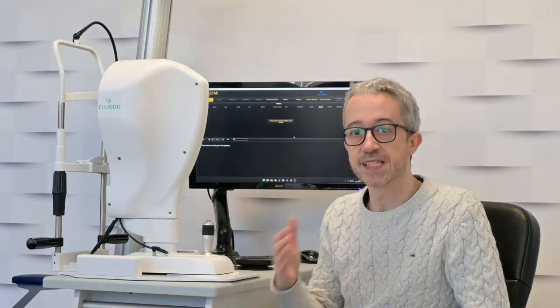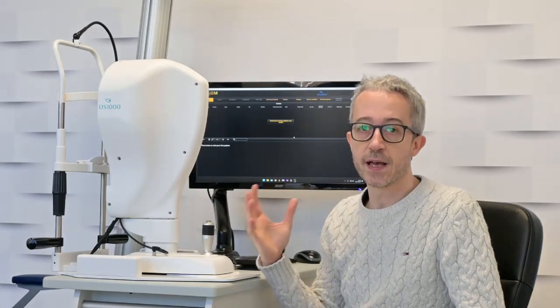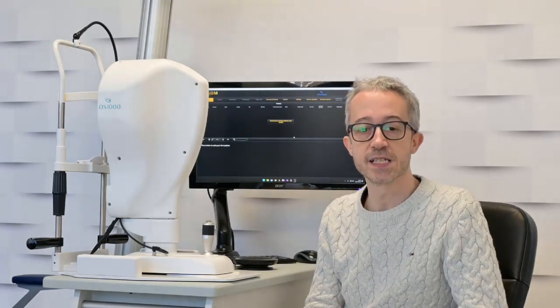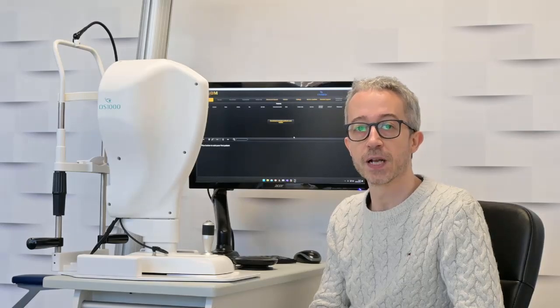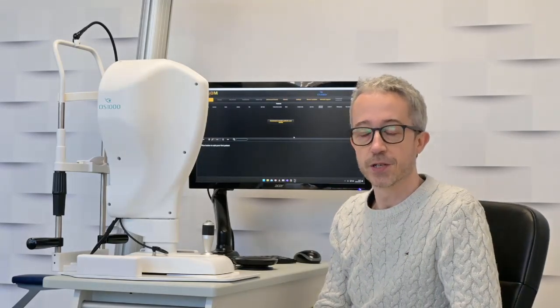In this case, it's the user who has to put the topographer and the subject perfectly in focus, and when the picture is correct and everything is in focus properly, the trigger button, when pressed, will take a picture.